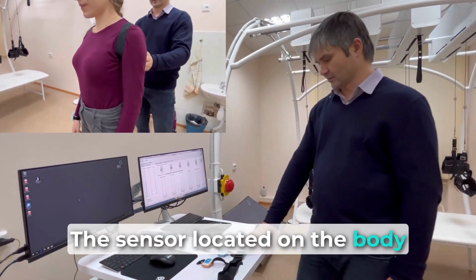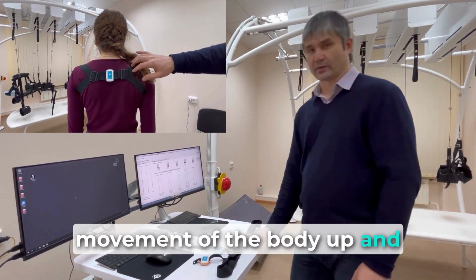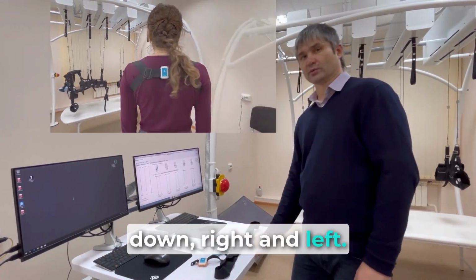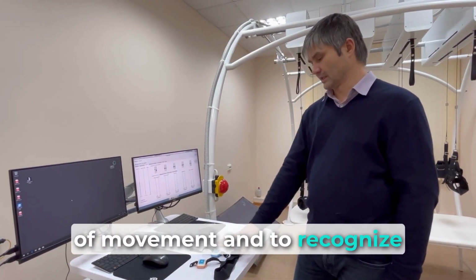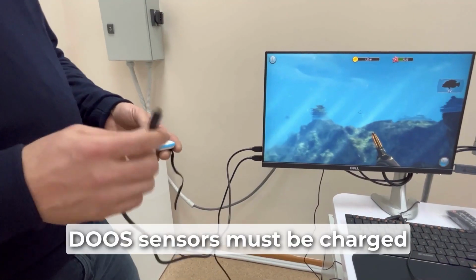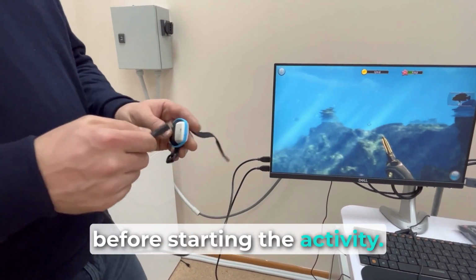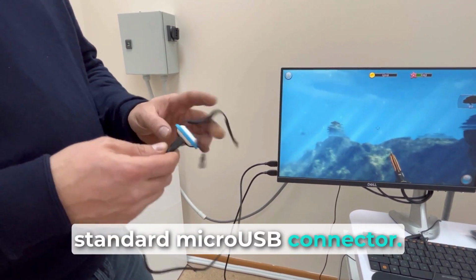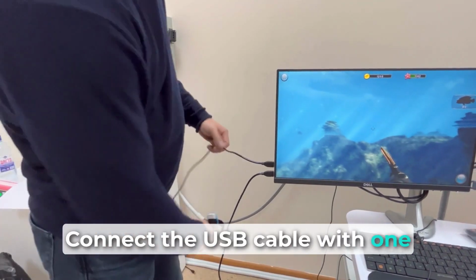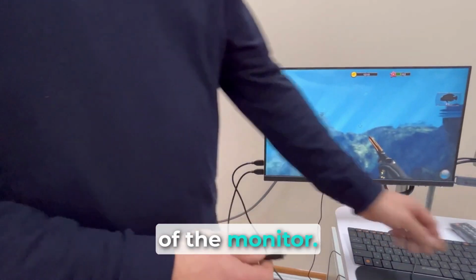The sensor located on the body is used to select the direction of movement and recognizes the movement of the body up and down, right and left. The sensors on the hands are used to select the direction of movement and to recognize gestures. DUS sensors must be charged before starting the activity. The sensor is charged using a standard micro USB connector. Connect the USB cable with one end to the sensor and the other to the USB connector of the monitor.